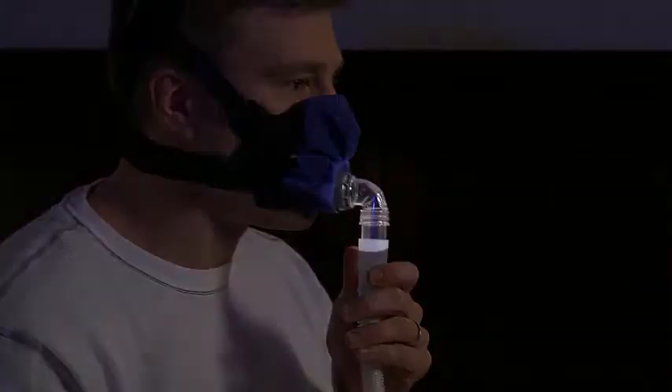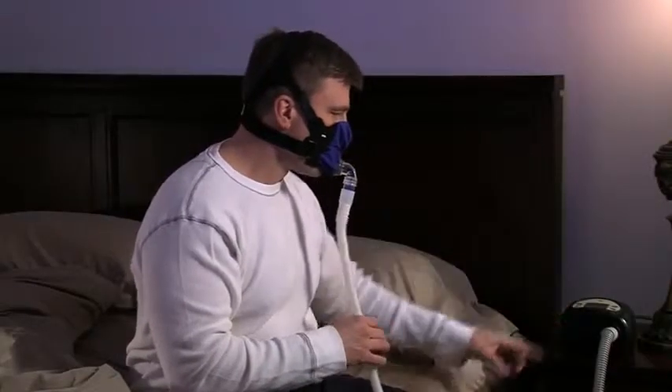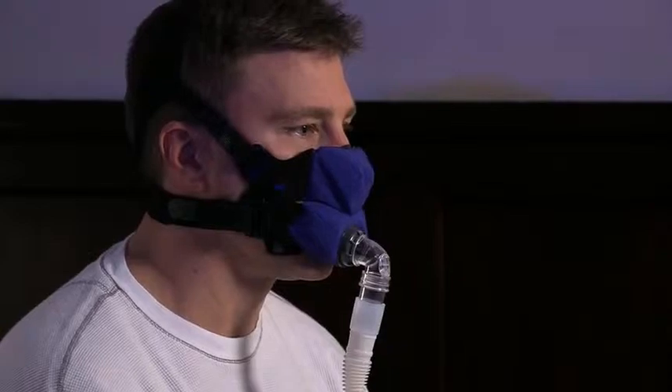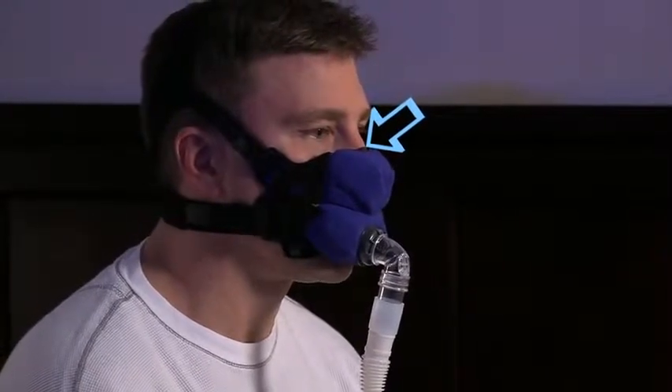Make sure that the other end of your hose is securely attached to your PAP machine, then turn on your machine. Both mask sections will inflate like a balloon to create the seal. A small amount of black fabric will show on the bridge of your nose when the mask is in use.